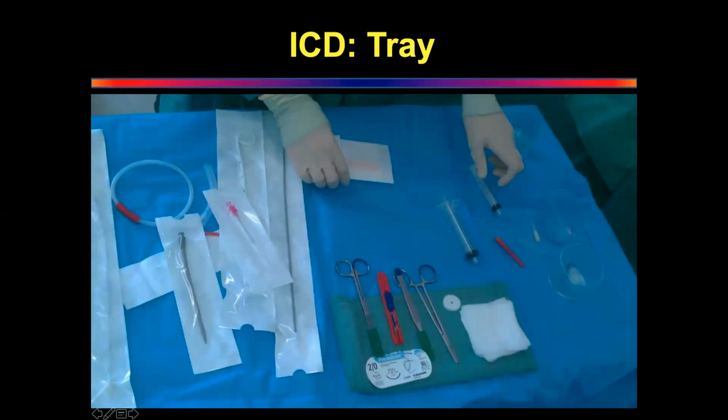Suture material. So my question to you is, what suture material do you use? 2-0, either ethylon or silk, or at some centers they use Prolene also. What is the answer? 2-0 silk, non-absorbable. This is Prolene. Even 2-0 nylon people use. 2-0 silk on a reverse cutting needle, 16 mm size. Excellent. I like that. The answer I want to hear is a non-absorbable suture 2-0 on a reverse cutting needle. And if you know 16 mm, it's even better.